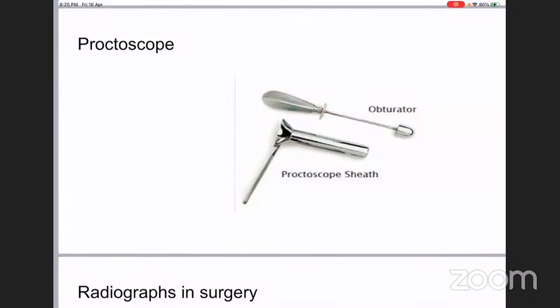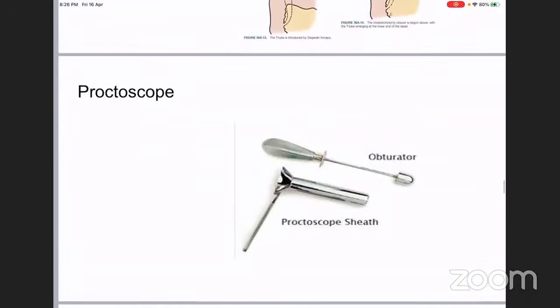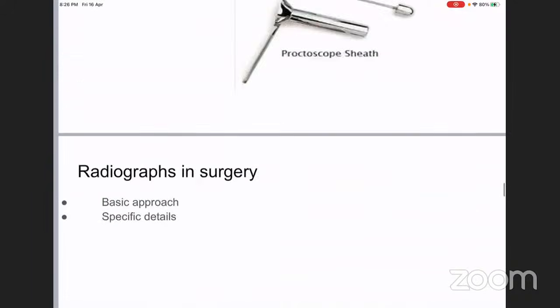Alternatively, you can put the patient in left lateral decubitus with both knees flexed, or on all fours, or in a lithotomy position. That is generally done in most bottom surgeries. But the most common office position for performing a proctoscopy is the Sims position. Very good. This was a very brief overview of the commonly used instruments. There can be many more instruments, but I just made a list of the frequently quizzed instruments and put it on the slides here. If there are any doubts, you can ask me about it later.